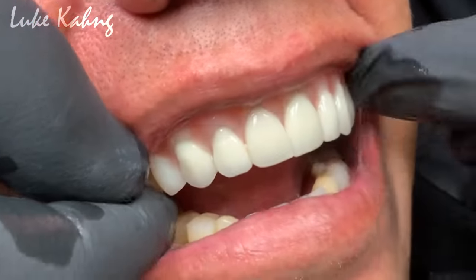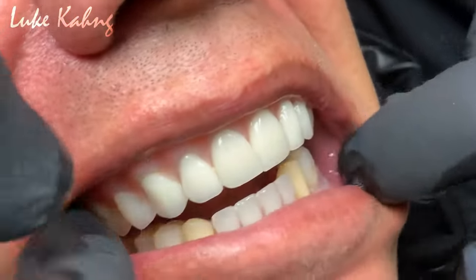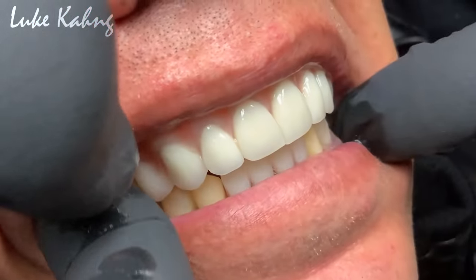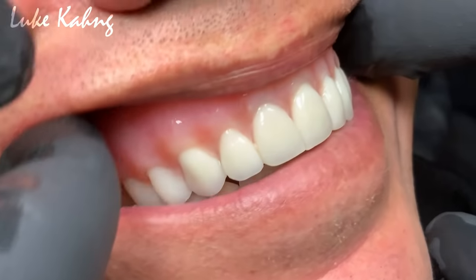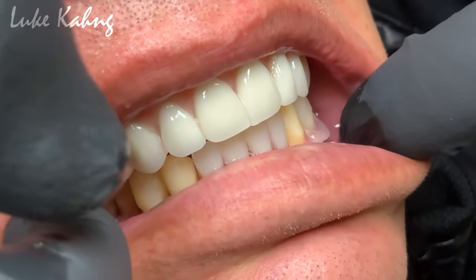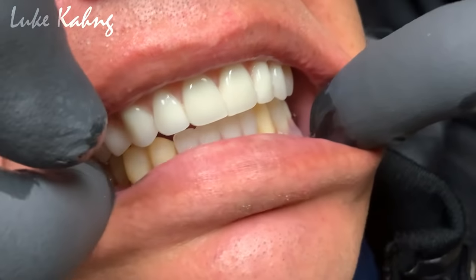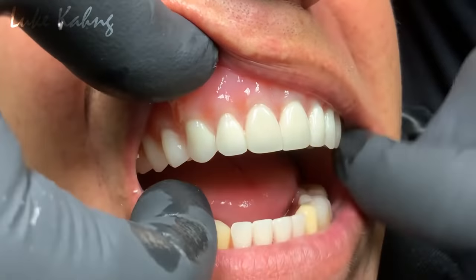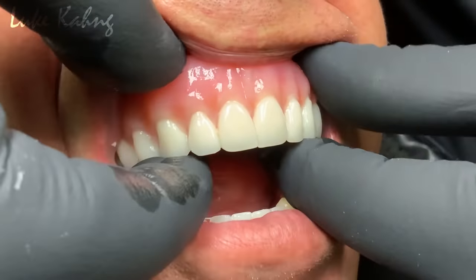And right now, we're done. We've made all the adjustments. Close. Close. Close. See, we've made all the adjustments. And everything is beautiful. So now he's going to follow up maybe 2 visits just to make sure we do some fine adjustments. Open. And again, listen.